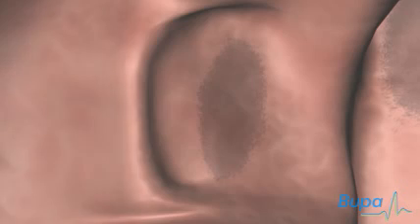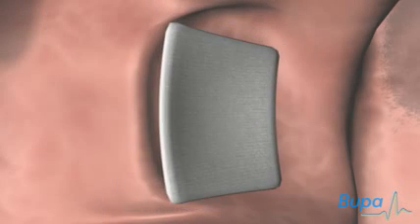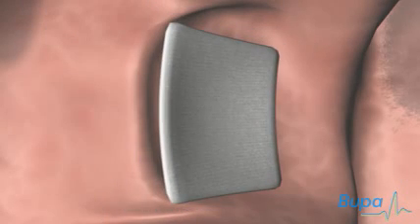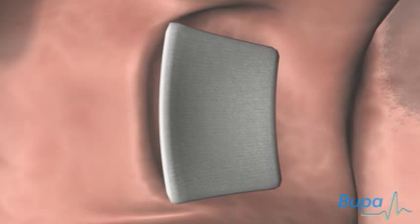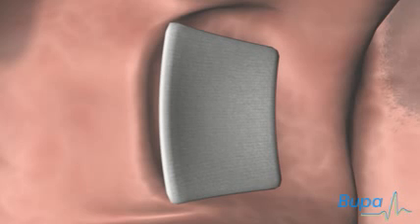The surgeon will press a gauze pad on the adenoid and tonsil area. Here we show pressure being applied to stop the bleeding.